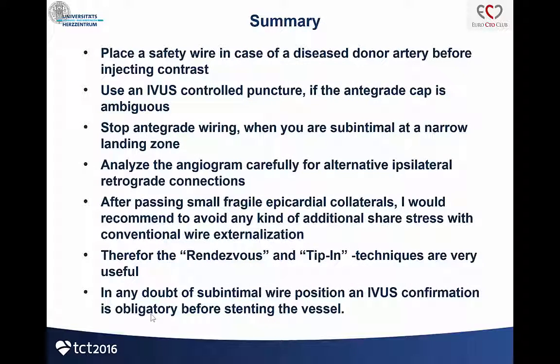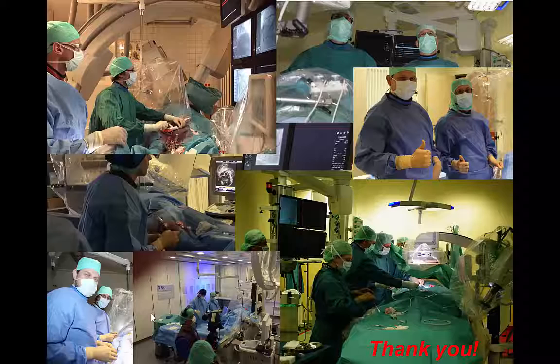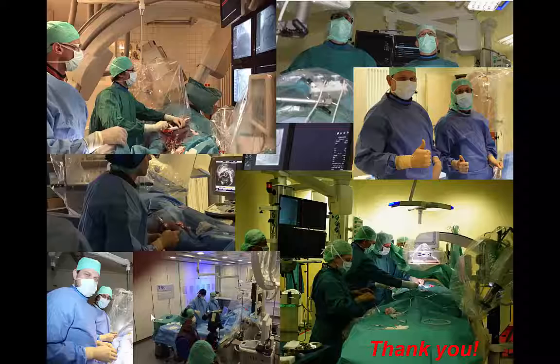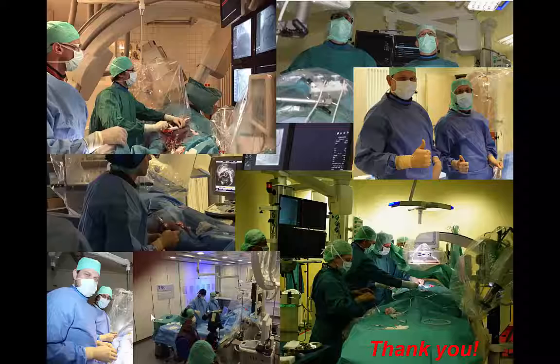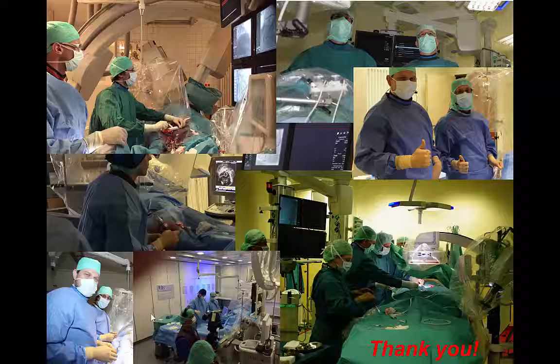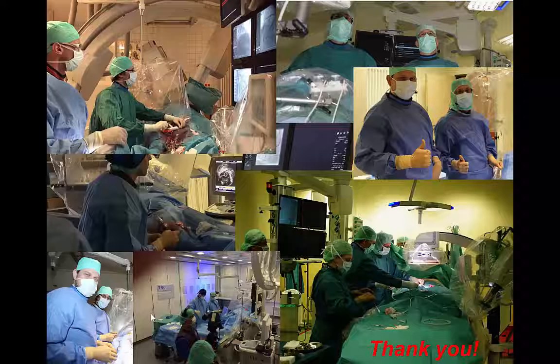Well, thank you, Kamis. That was another great case. The lesson here regarding the RCA injecting and having a little stain — having a protection safety wire can go a long way. There is a current question: do we put a routine safety wire in the retrograde donor guide? Your approach suggests that maybe putting a safety wire is a good thing — it protects you in case of dissection or something else happens. Also, if you don't have the septals, the epicardials are still there and you can go retrograde to get it recanalized.